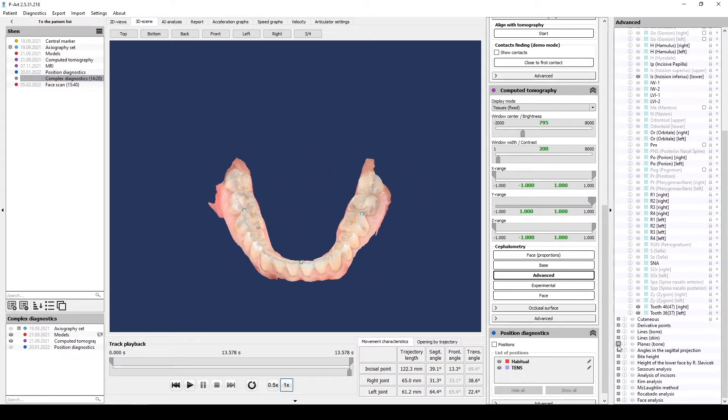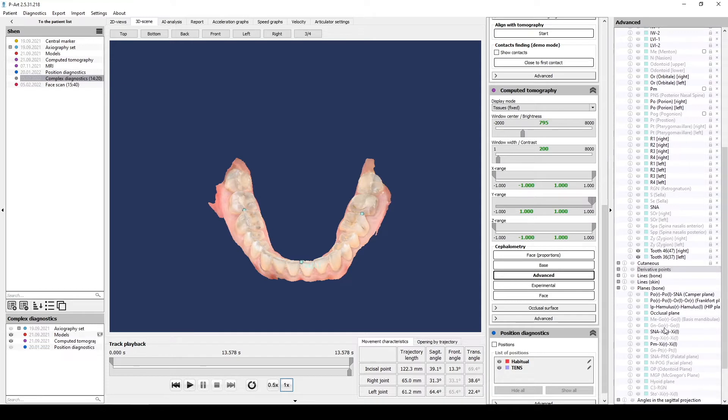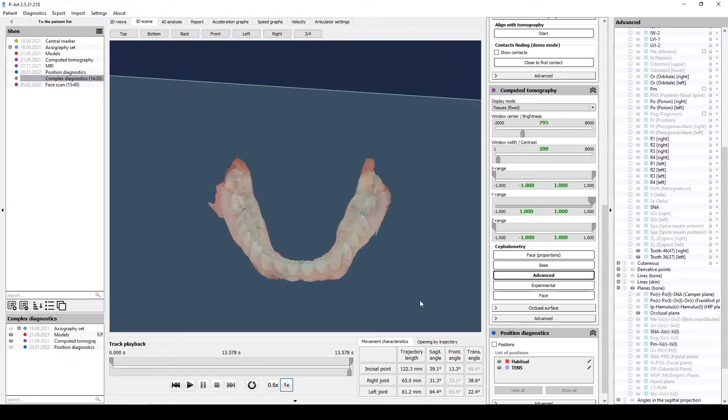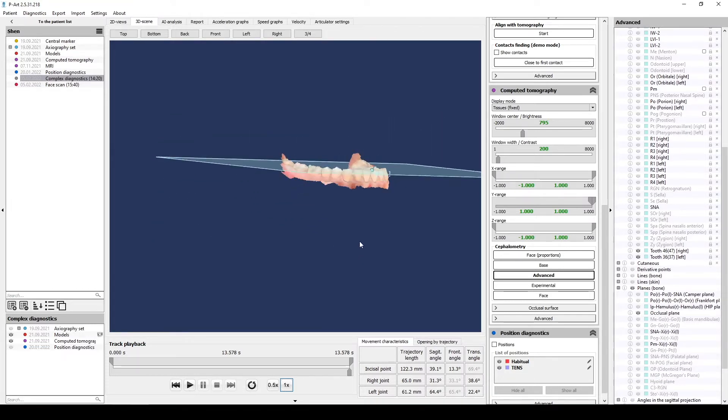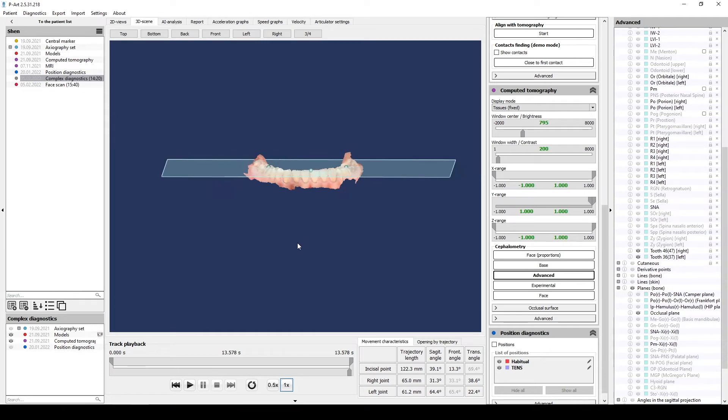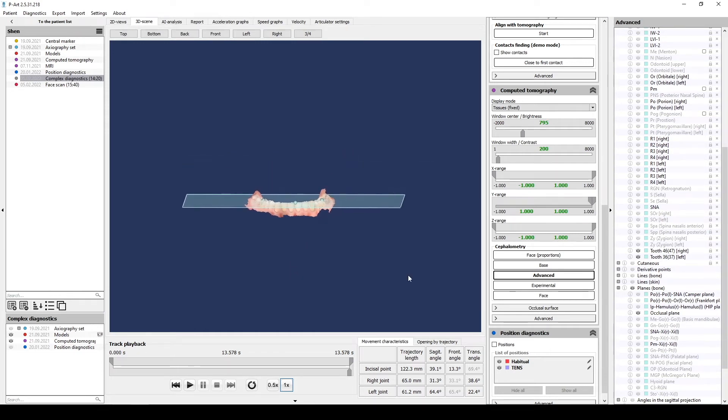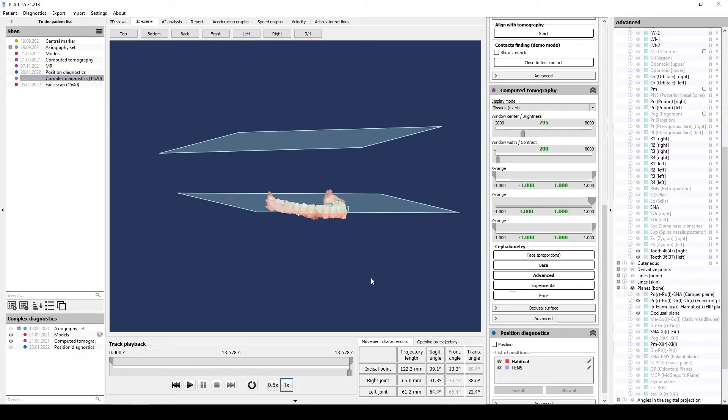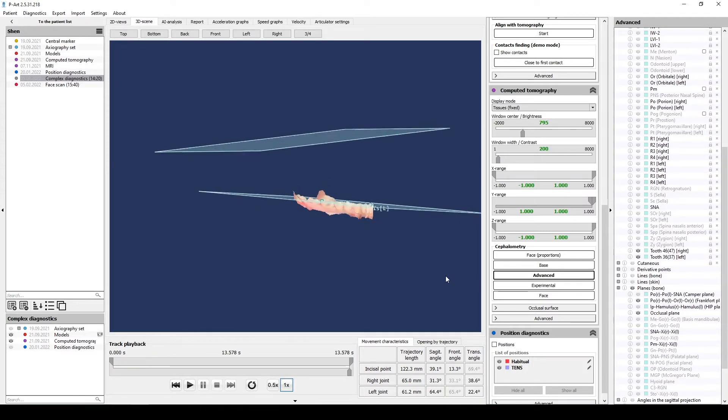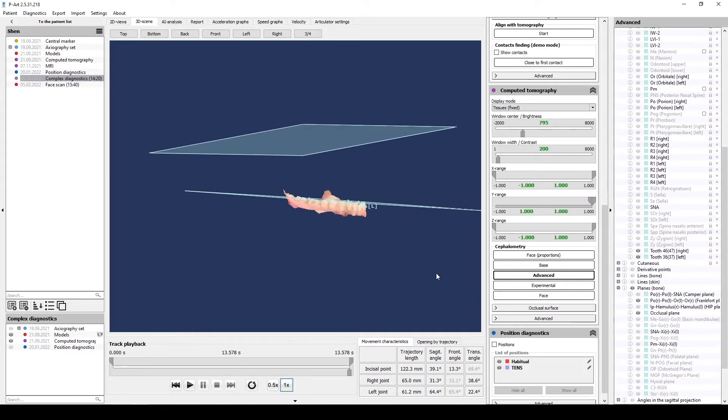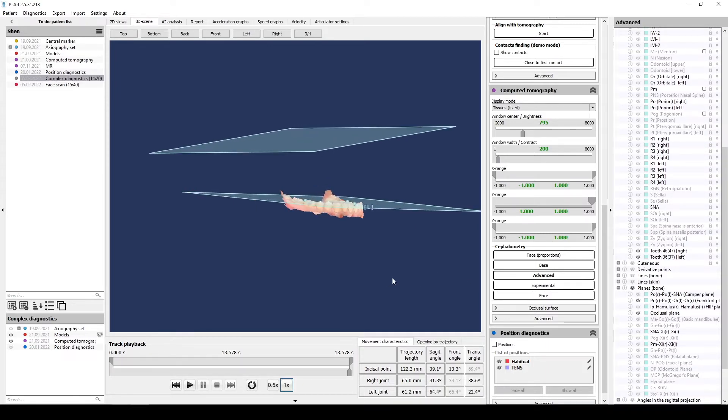After that in the planes, bone, activate occlusal plane. For easy calculation activate Frankfurt plane. Frankfurt plane is lined between two porion and two orbital points.